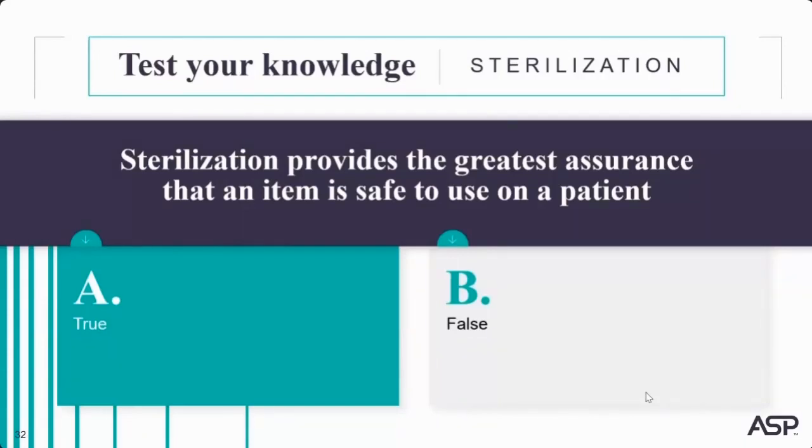In conclusion, we have learned what laryngoscopes and bronchoscopes are, how they are used, and the challenges that are presented when reprocessing these devices. Inadequate reprocessing, as well as other variables, increases the risk of infection to patients. There are many things that can be done. For example, following the manufacturer's instructions for use when reprocessing laryngoscopes and bronchoscopes to strive for best practice. And of course, patient safety.